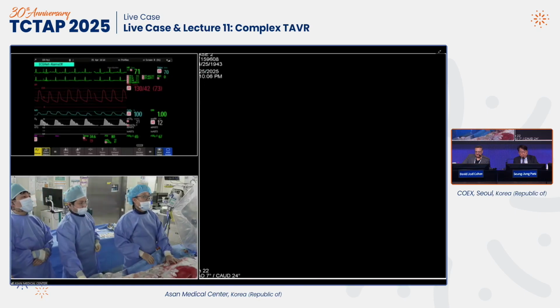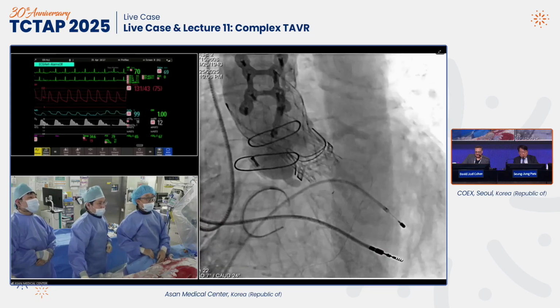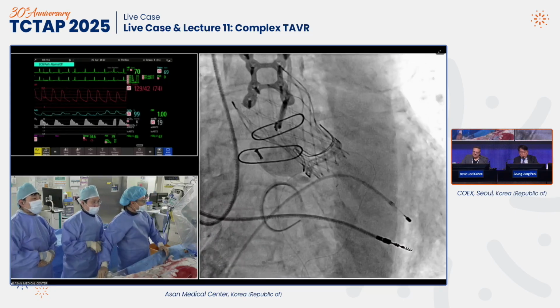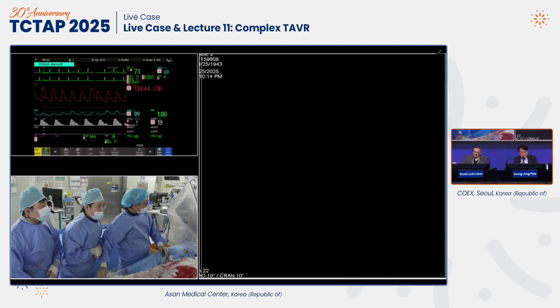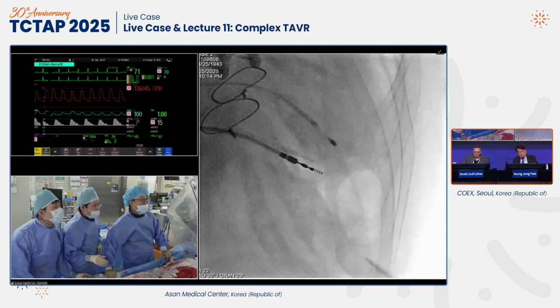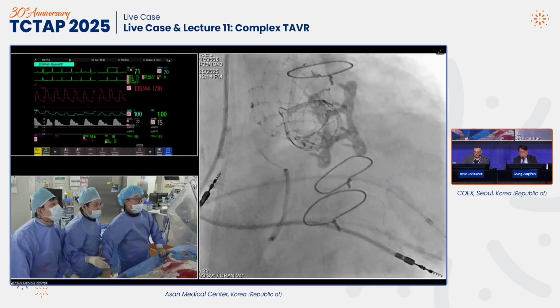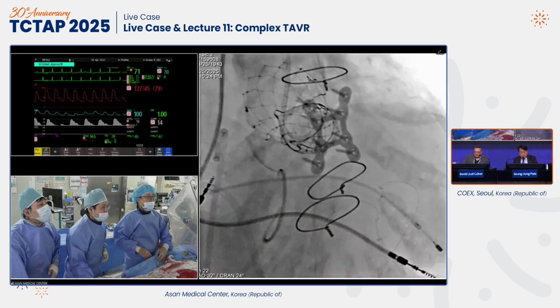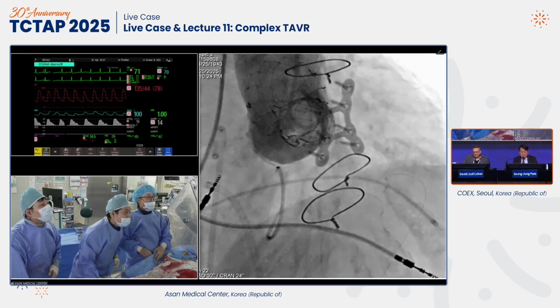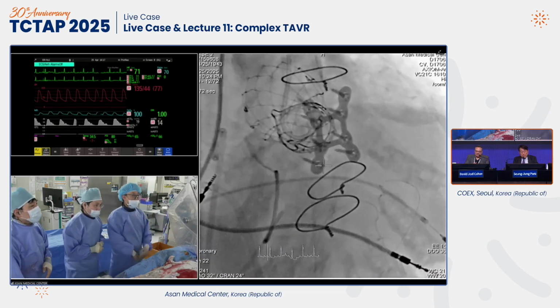Carefully. Push. Yeah, coronary flow is good. I think it's perfect. And we're going to show the en-face view. No AR, yeah, no coronary obstruction. Okay, over here. It's great. Near the en-face view. Okay. Nice. Good. Perfect. Yeah, I think coronary flow is good. There's no AR.